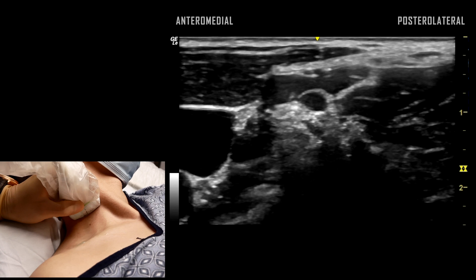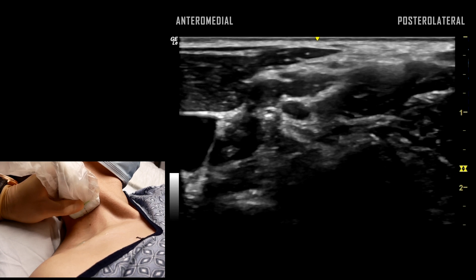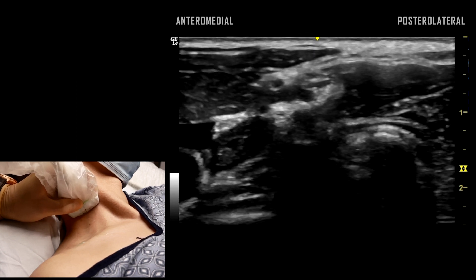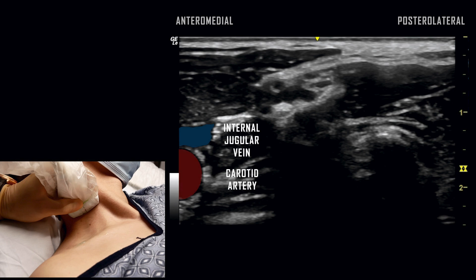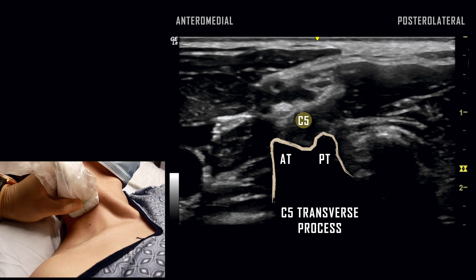As the probe continues to be translated cephalad, the internal jugular vein and carotid artery are now visualized together. The C5 nerve root is visualized between the anterior and posterior tubercles of the C5 vertebra, a structure with similar features to C6.